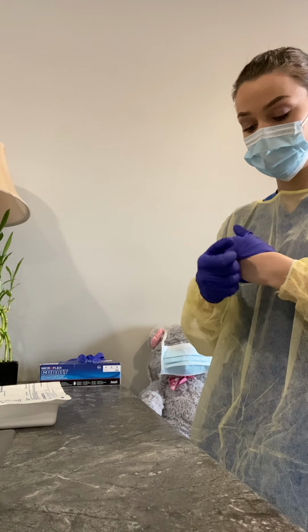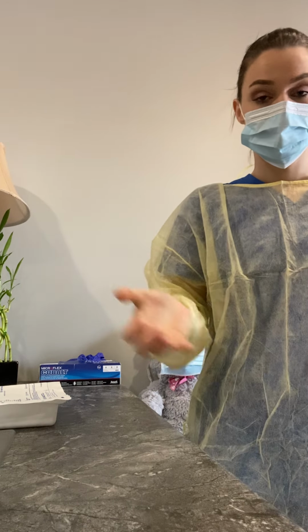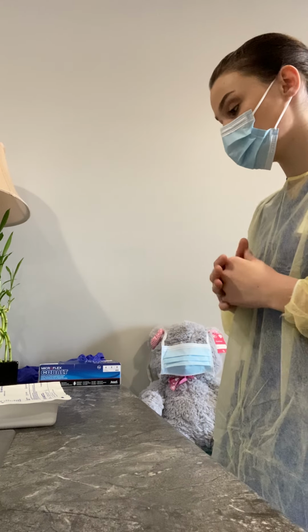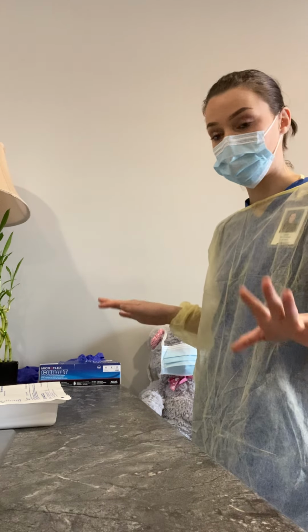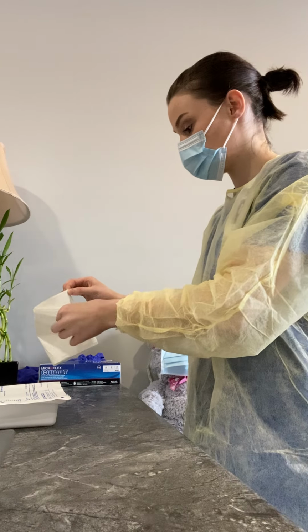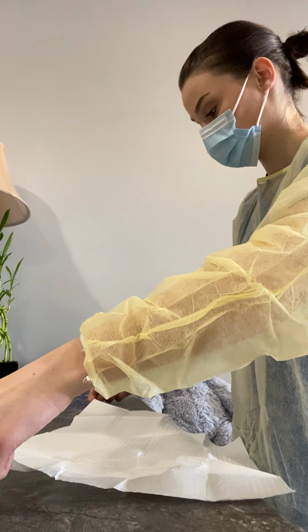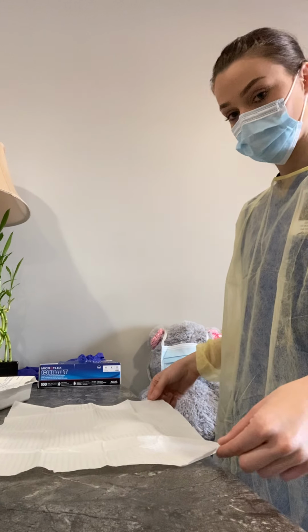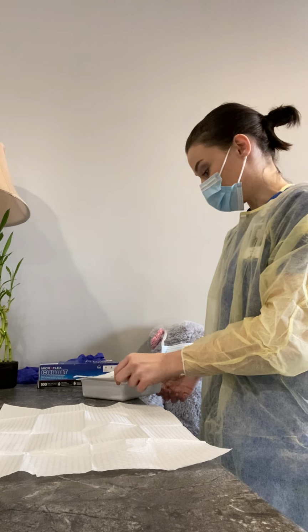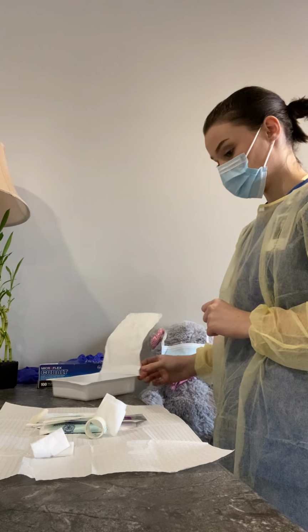I'm going to take off my clean gloves, discard that dressing per the facility's policy. And then I'm going to go ahead and prep my sterile field. So I've got my sterile drape. I don't have much room to work with here. All right, so there's my sterile drape. I'm going to open my dressing change tray. Dump that. Okay.